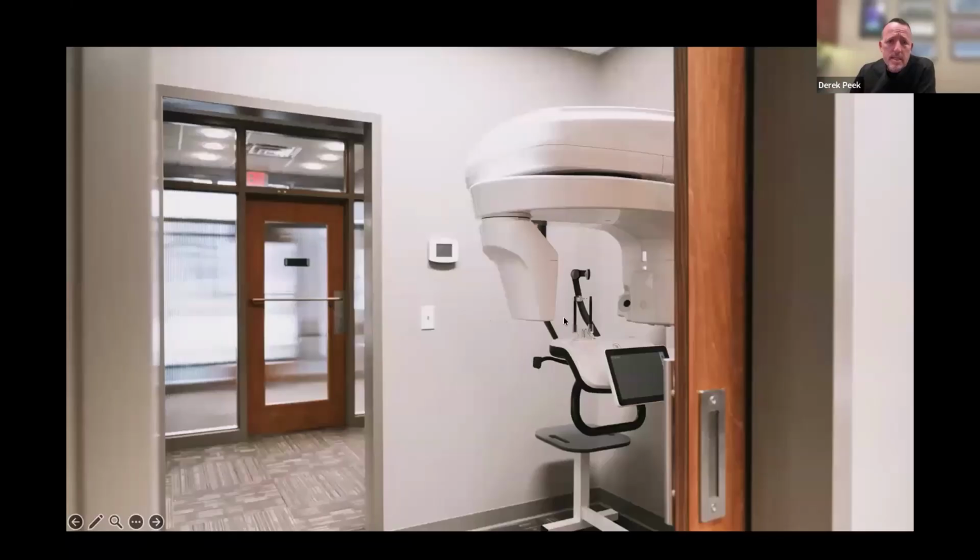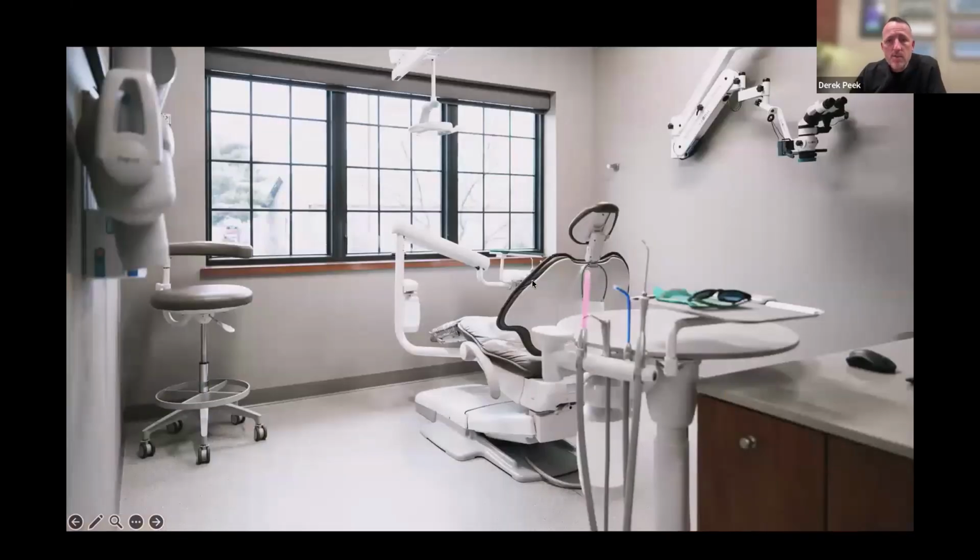Make sure that CBCT is right off the door that goes from the waiting room, so you take that right away. I know we just came out with the new protocols for CBCT, and I read that yesterday, and I'm pretty certain it said small field of view on almost all of them. So I think that's an important thing to have in your practice. Also, big rooms with windows. Don't make it cramped. Make it bigger than what you think you need.